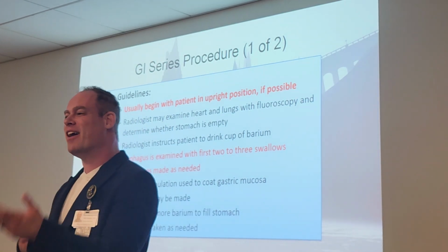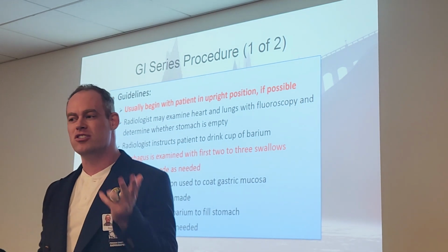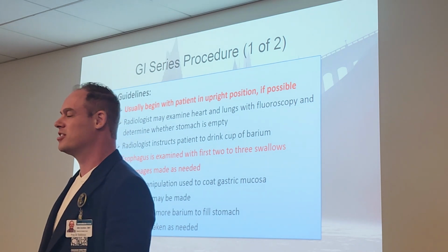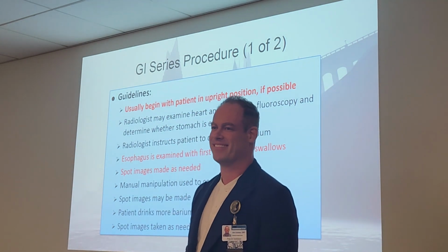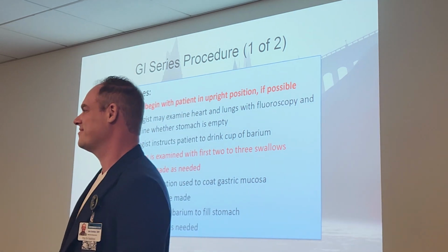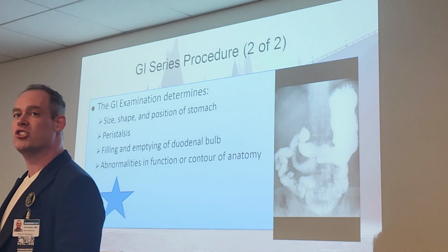And then, after the esophagus has been evaluated, the doctor will then, as you guys have seen, start flipping the patient all over the place and taking those spot films. Spot images made as needed. Spot images taken as needed, just so you know. Okay, so what is the upper GI going to determine?